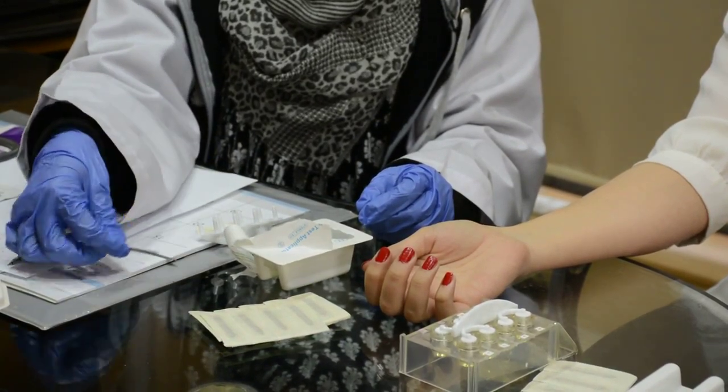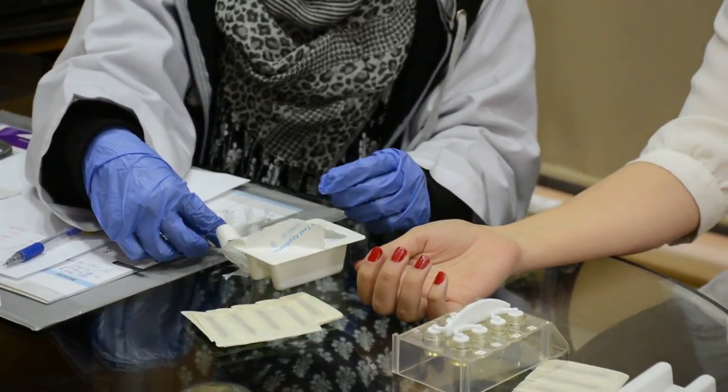This applicator is quick, convenient and easy to use, and also painless.